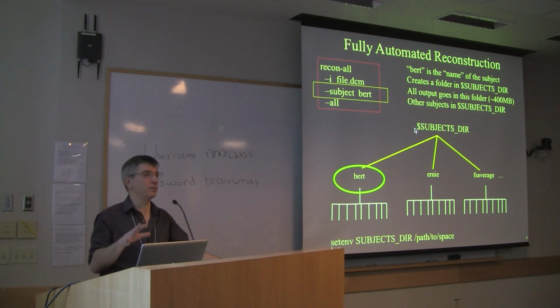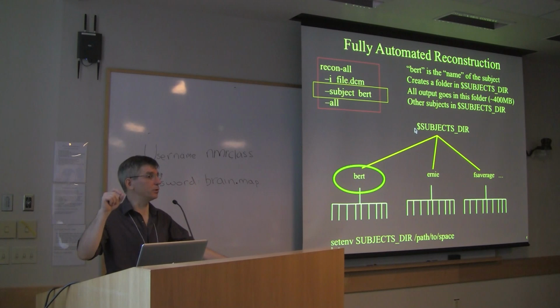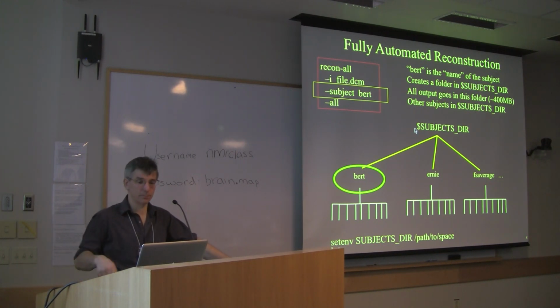Every program on your computer now knows what this printer is because it's become part of your environment. And so it's the same thing with this SUBJECTS_DIR variable. It's something that gets set and it's configured into your environment. And so every FreeSurfer program knows where the SUBJECTS_DIR is. And so you can think of it as the root of a tree, and then everything, all the subfolders underneath that tree, are where all of your FreeSurfer data will be stored.